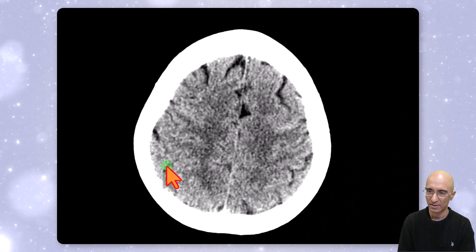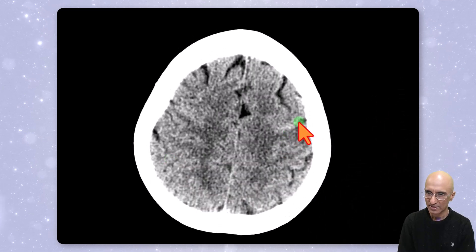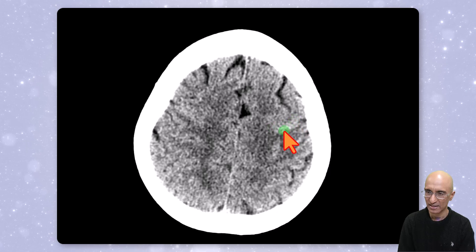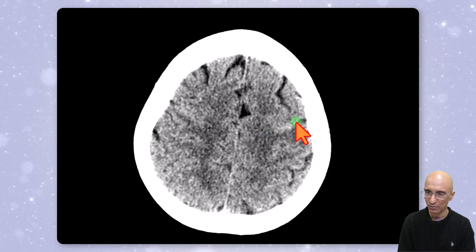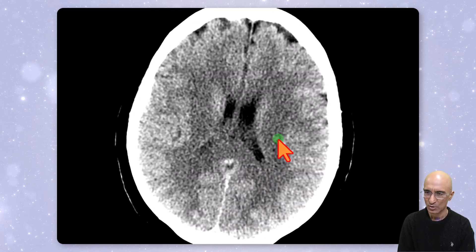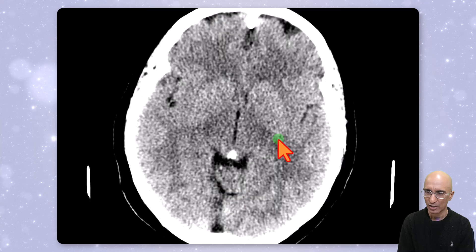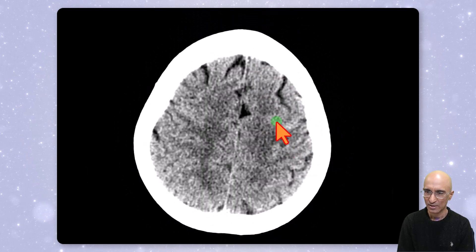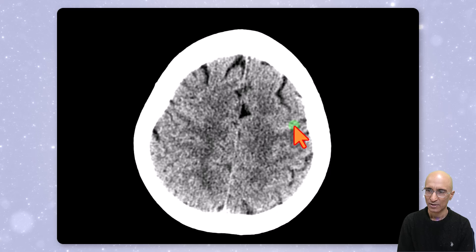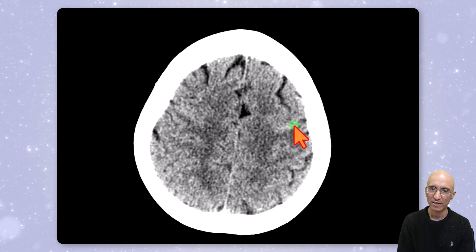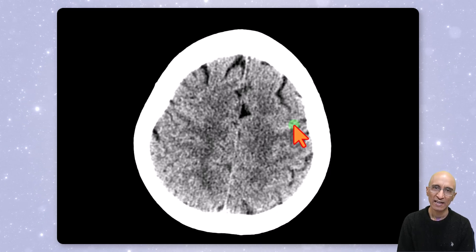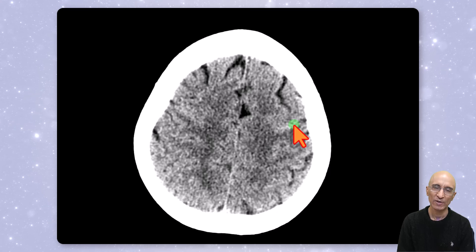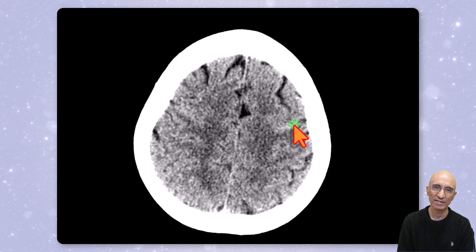On the CT head examination, as I scroll through, we can see subtle increased density in the left frontal sulcus. There were no other acute findings on the CT examination, so this finding was concerning for acute subarachnoid hemorrhage. The patient underwent a CT head angiogram, which was negative for any obvious aneurysm or vascular malformation.